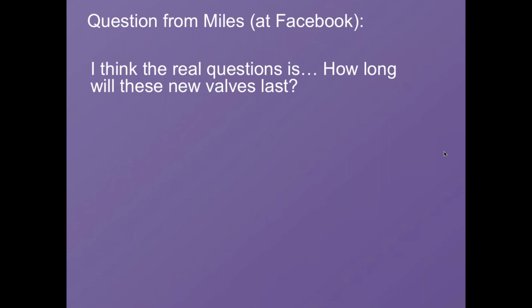To date, we have some 7-year and even some early 10-year data that are comparing head-to-head with surgery that look to show a similar durability. Having said that, we do not have really good long 15-year or 20-year data, which we do have on surgical valves. So I think some of this is unanswered. It looks favorable at this point in time, but we don't have that direct head-to-head comparison. Those studies are ongoing, and as we continue to collect data, it seems to be indicating similar durability, at least at this point in time.